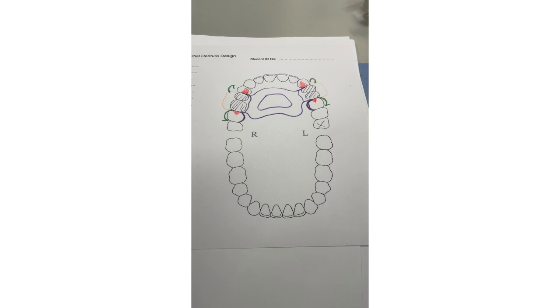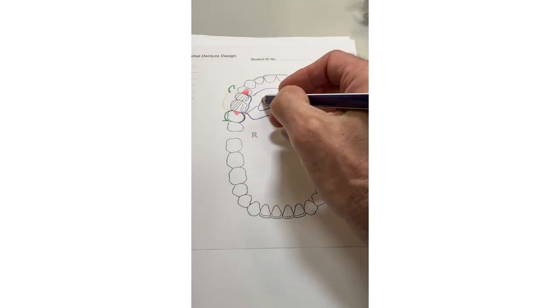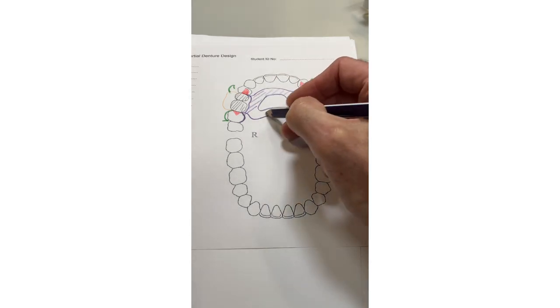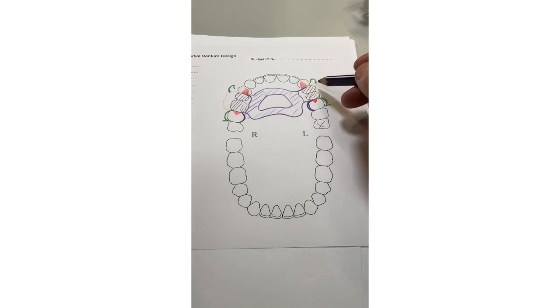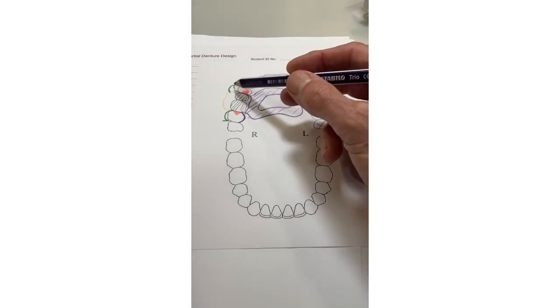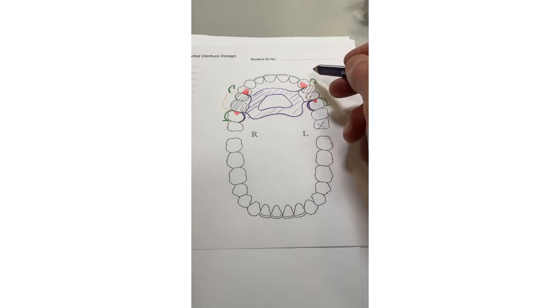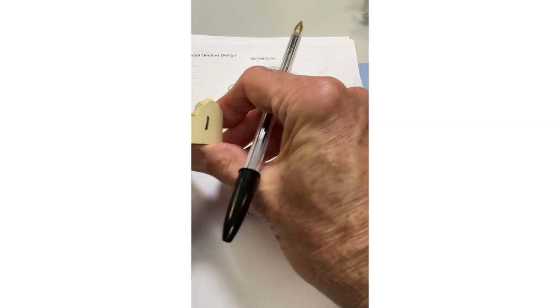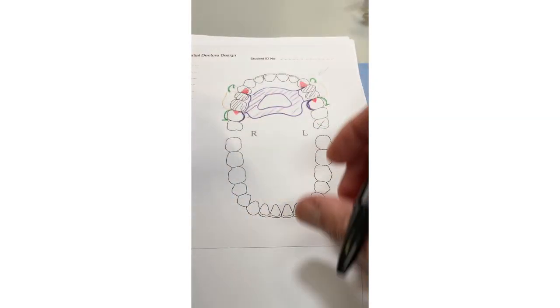Shade in the metalwork to show what the denture base looks like. To check your design at the end: check you've got the saddle supported at both ends, you've got a clasp on both teeth — the only downside is visibility. If the patient didn't like this clasp, you could omit it and use the molar clasp at the back. That's the Kennedy Class III case upper partial denture.